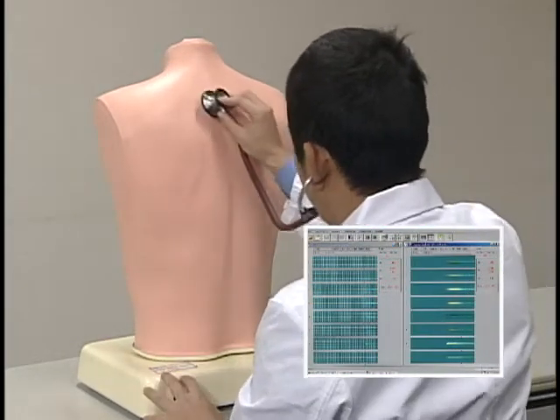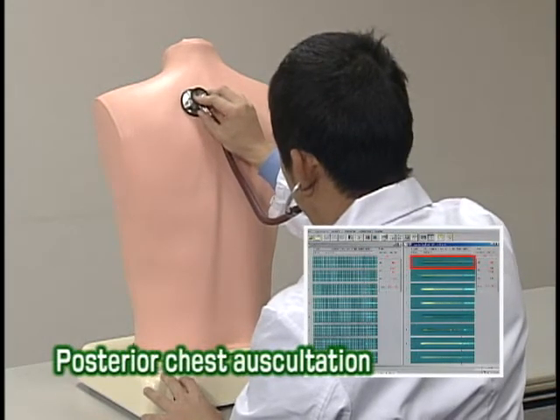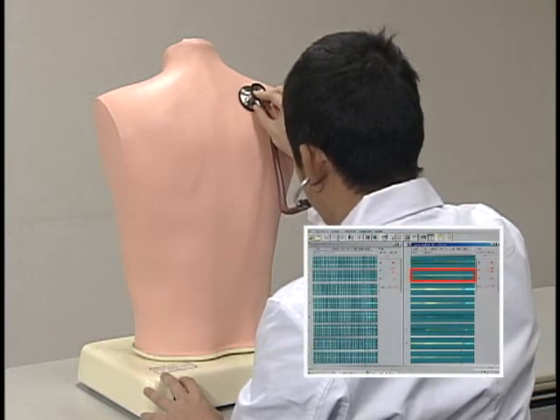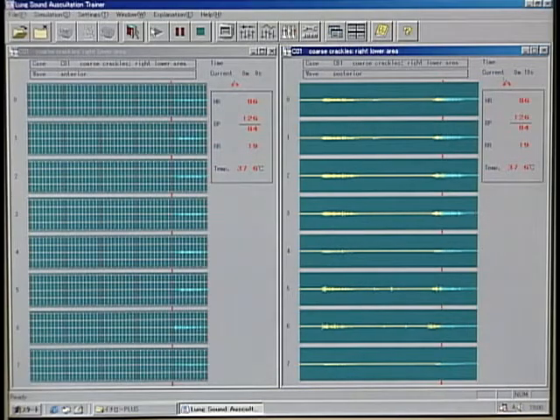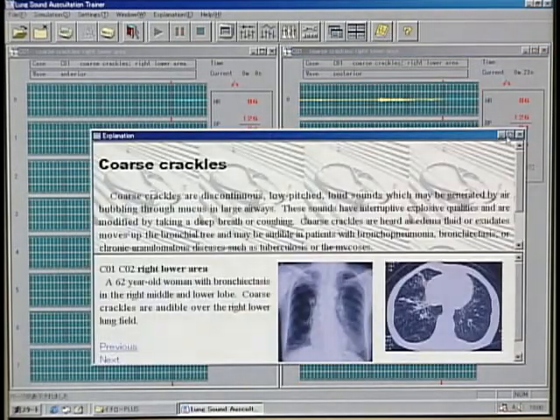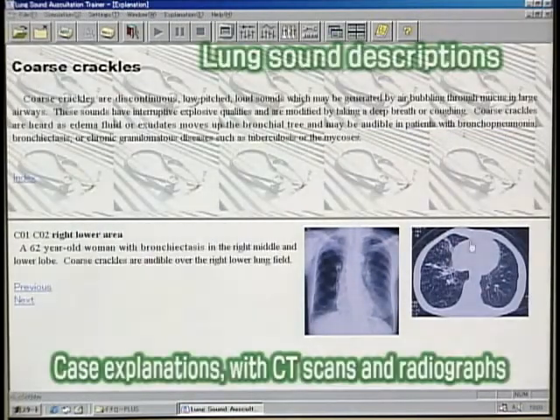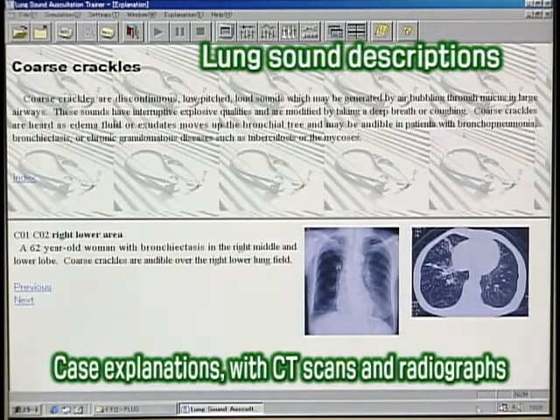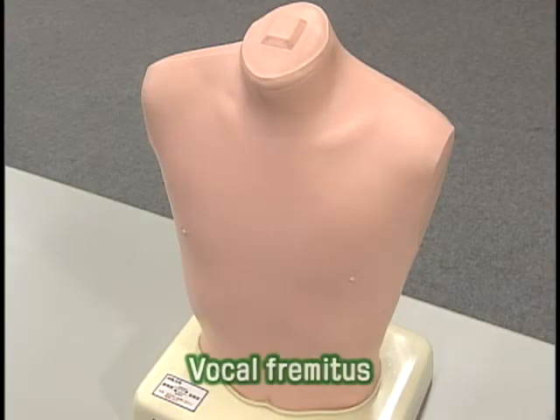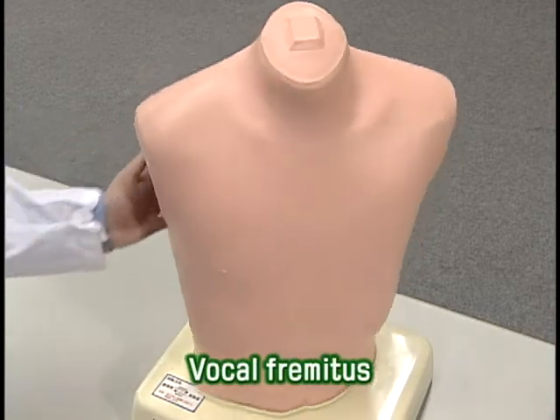Posterior chest auscultation. Dynamic sound graphs and vital signs data are displayed on the monitor. Explanatory windows on the current example can be opened with a single click. Vocal fremitus can be palpated.